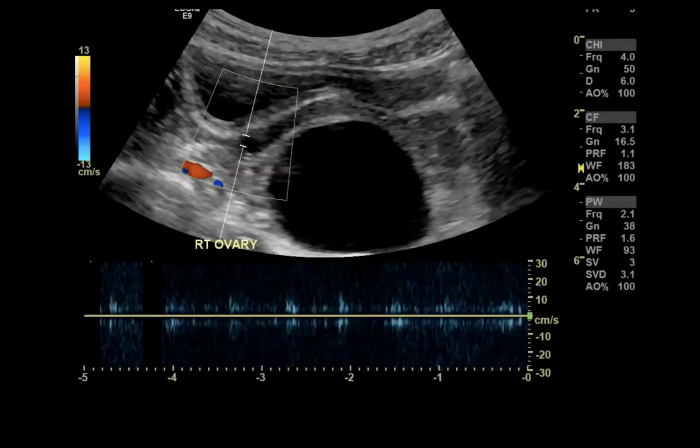So this is the ultrasound. What you're looking at here is that the transducer is placed on the belly. And then you can see here there's an ovary, which is this small structure here. And I think there's a portion of it that looks a little different back here, but wasn't necessarily recognized as such. It's a Doppler exam. So you can see the color Doppler, and there's no obvious flow there, but then on a pulse wave Doppler, you see some arterial flow. And back behind here, I'm not entirely sure. I think this is a fluid-filled rectum.